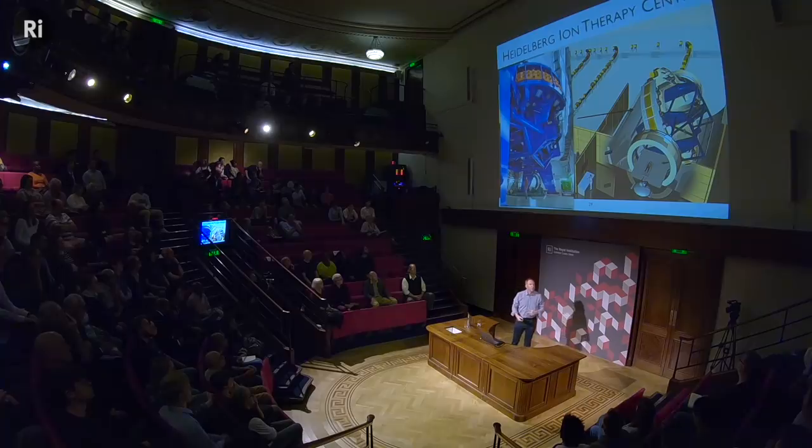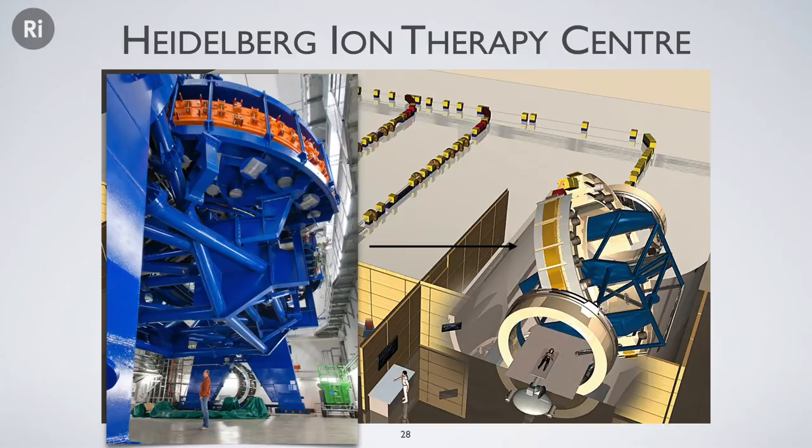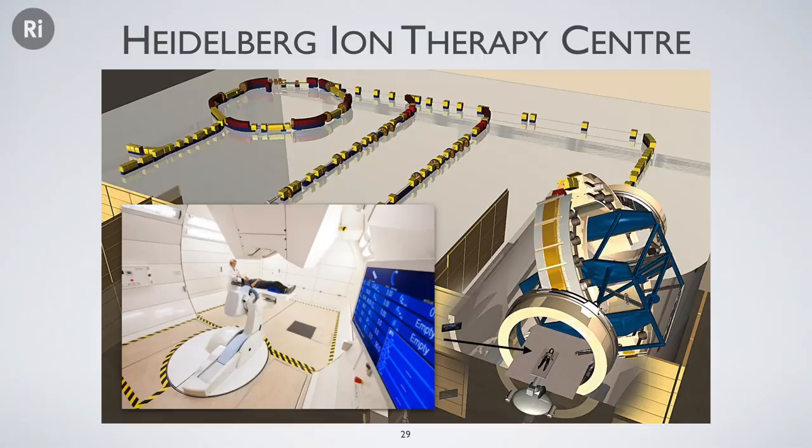The big difference between X-ray radiotherapy and particle accelerators is how you deliver the beam from all directions around the patient. The gantry in proton and carbon therapy is much bigger than it is in X-ray radiotherapy. And a problem like this does not exist in pure particle physics, where you have to mount your accelerator beamline to an enormous rotating structure that allows you to deliver the beam from any angle to the patient, and with millimeter precision so you get the beam exactly where you want it. At the end of this gantry, you have the treatment room, what's called the nozzle. That's where the beam comes out.